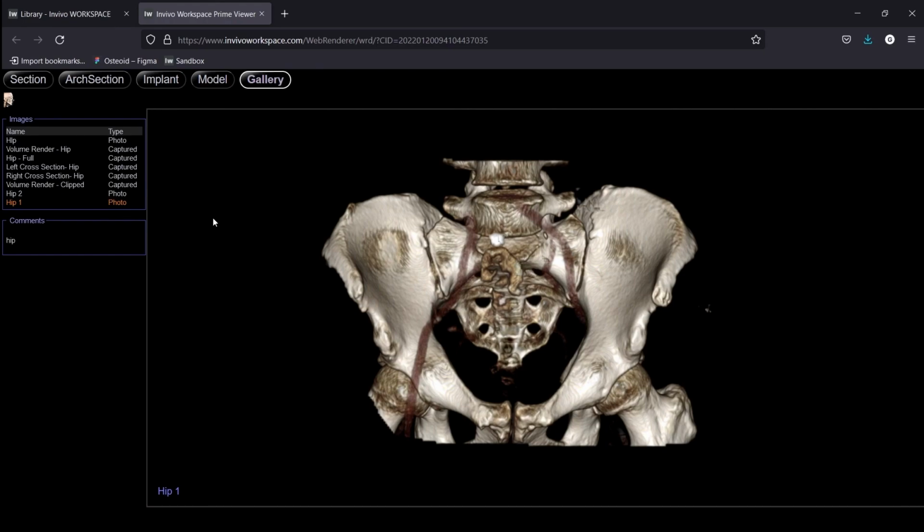So today we've covered how to take images and send them to the gallery, how to do the lay an egg process, which is saving your case and combining it with a viewer, to view stuff on local computers. And then we also talked about how to send your case to the cloud so that you can view it anywhere that you have a web browser.